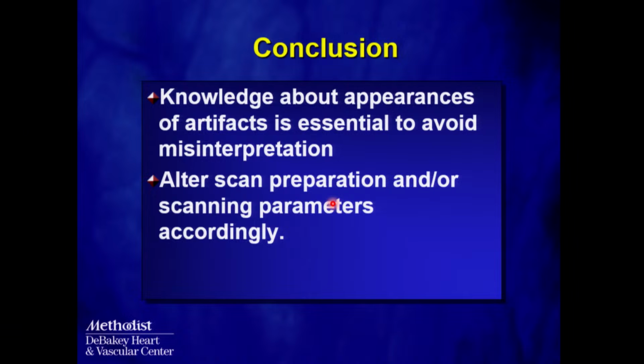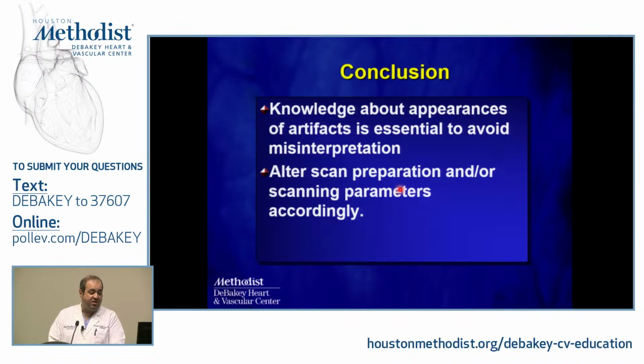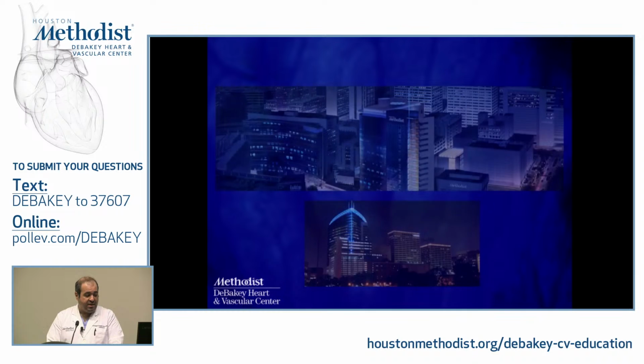So to conclude, knowledge about the appearances of artifacts is essential to avoid misinterpretation, and altering the scan preparation and the scanning parameters accordingly will be the way to get away from those artifacts. With that, I would like to conclude and thank you all for your attention.